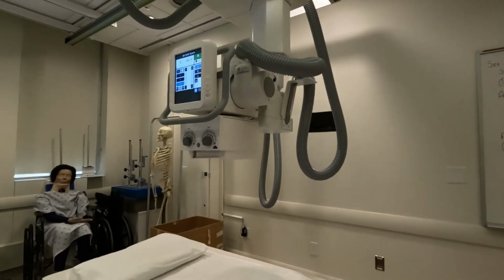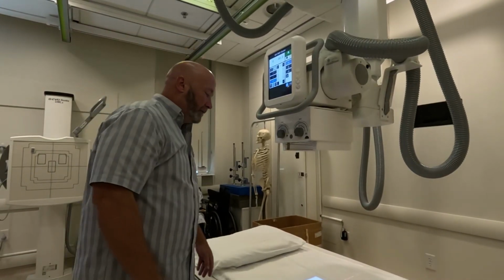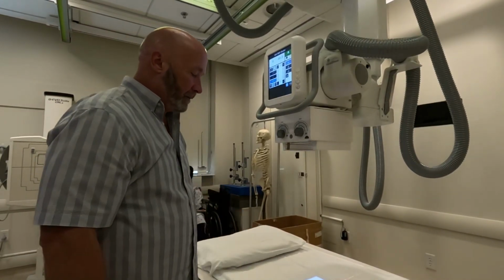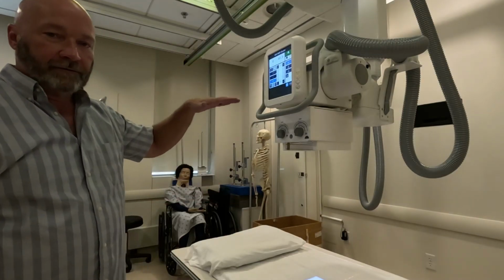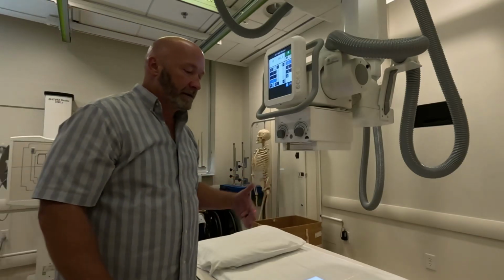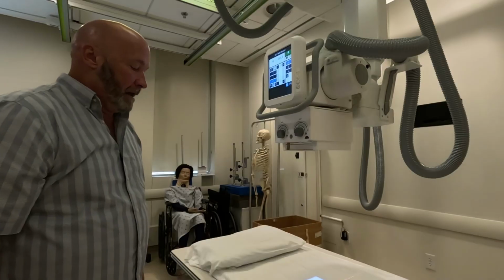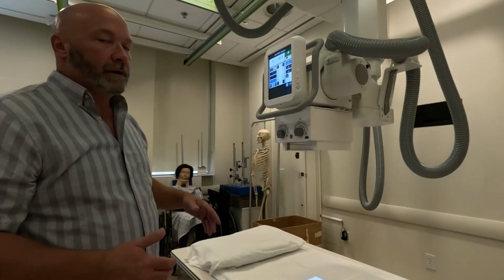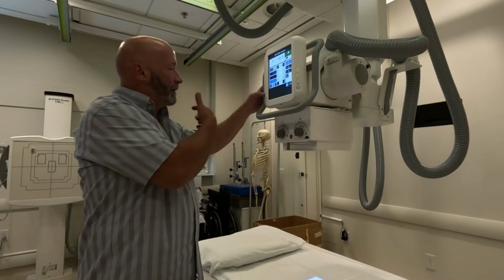So what you'll also notice potentially is that you're offset on the table. Okay, so this locks you in to the correct height from the image receptor. But what it does not always do is lock you into the center of the table. And that's because the table can move. What you need to get used to on the table bucky is kind of the same thing that you got used to on the wall bucky.